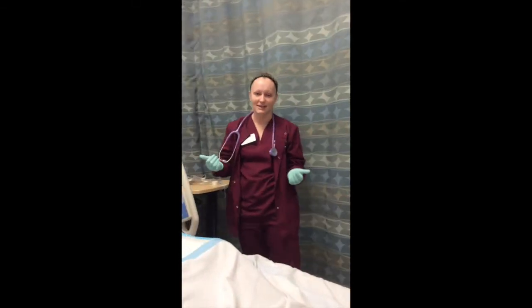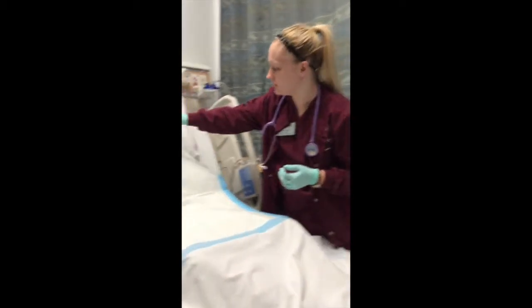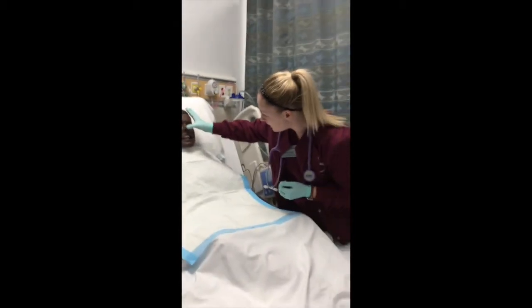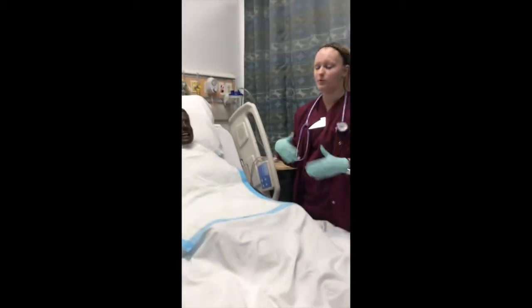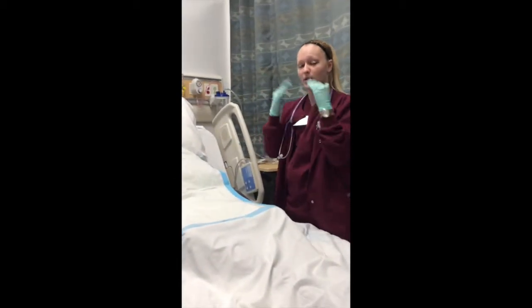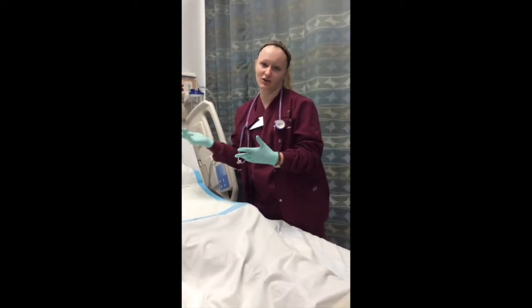So after I've got my tape ready, I'm going to go ahead and assess my patient. Like I said, I'm going to check their nostrils. I'm going to make sure there's no perforations, no deviation, no polyps, no obstructions. I'm going to have them blow their nose to see which nostril I'm going to choose. And I see that their left nostril is best.